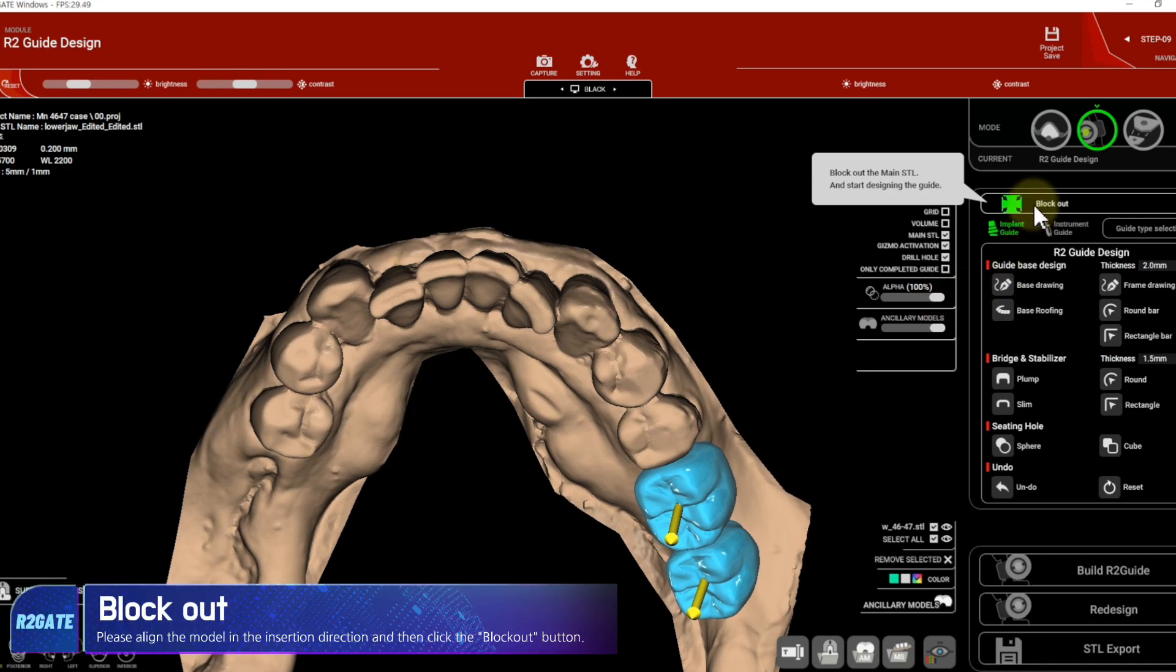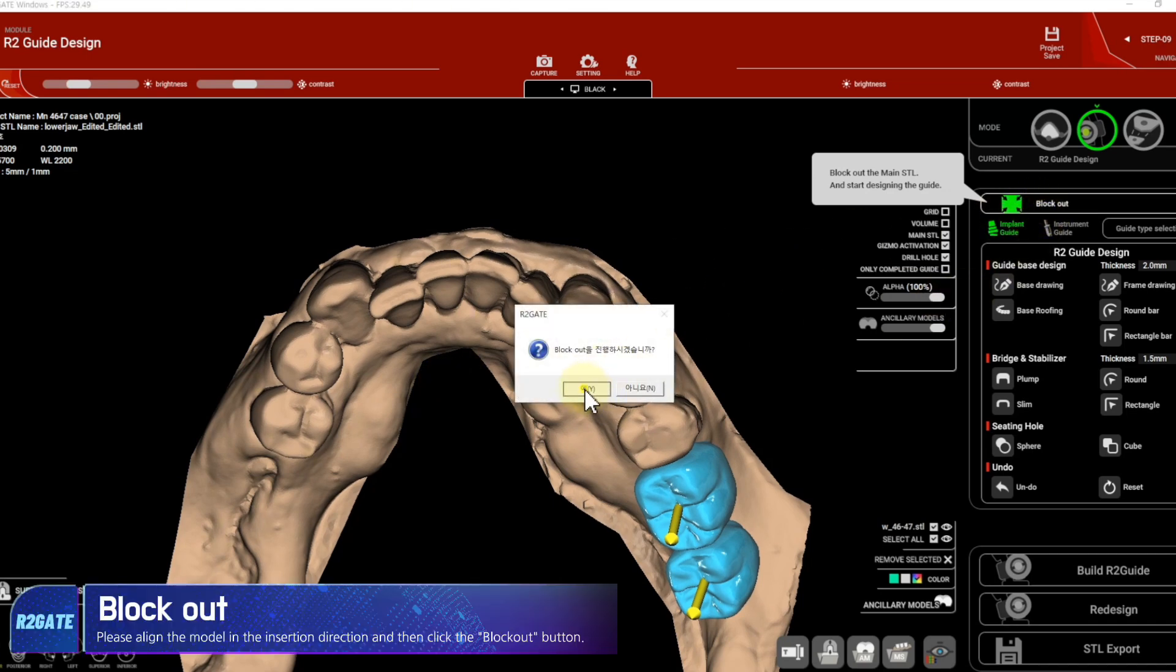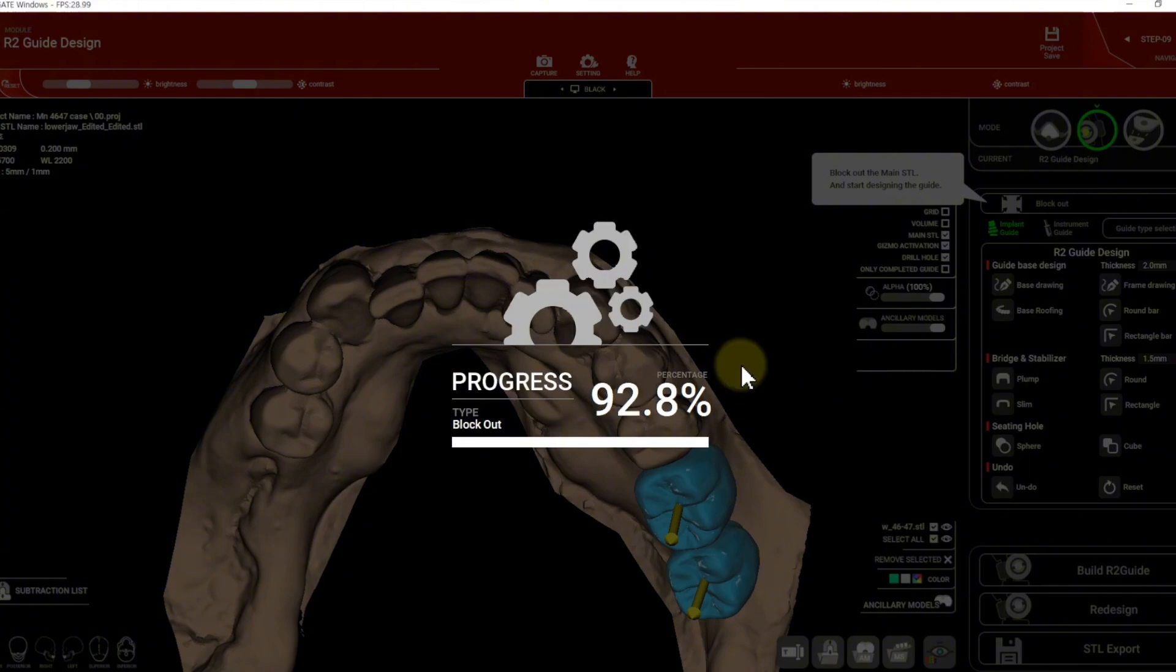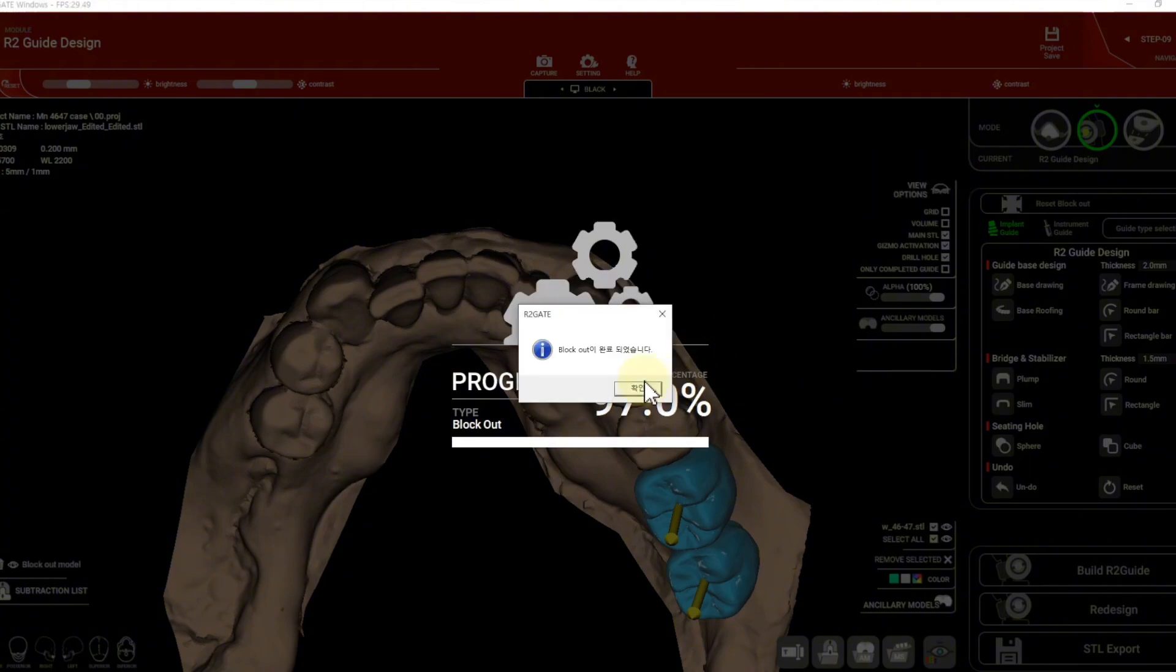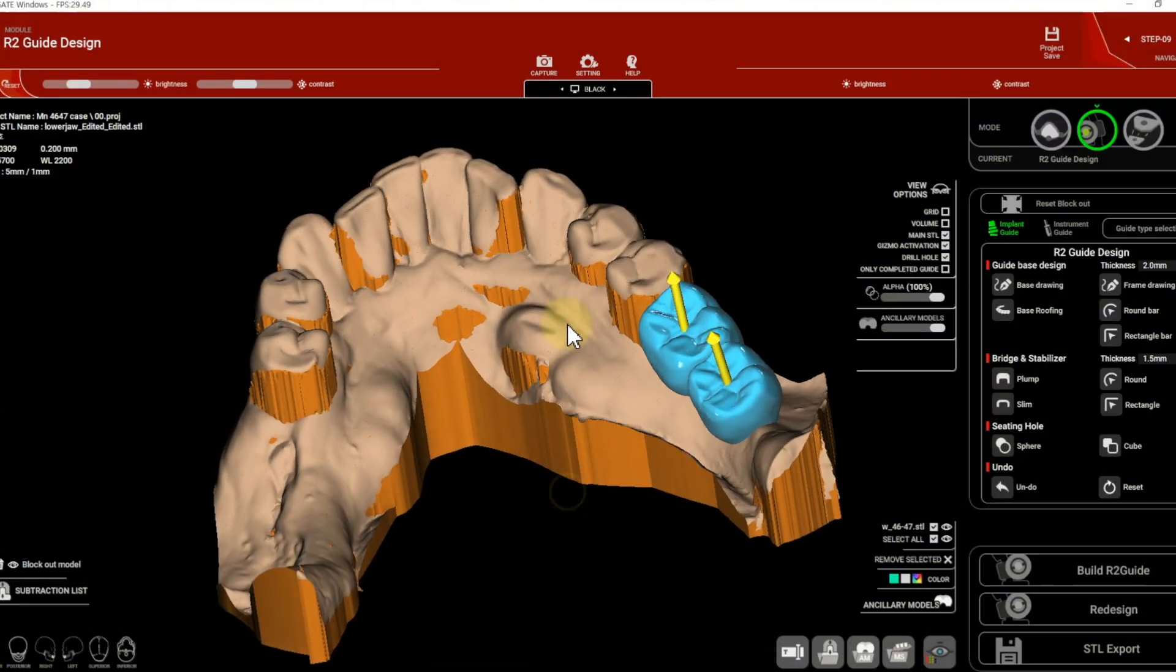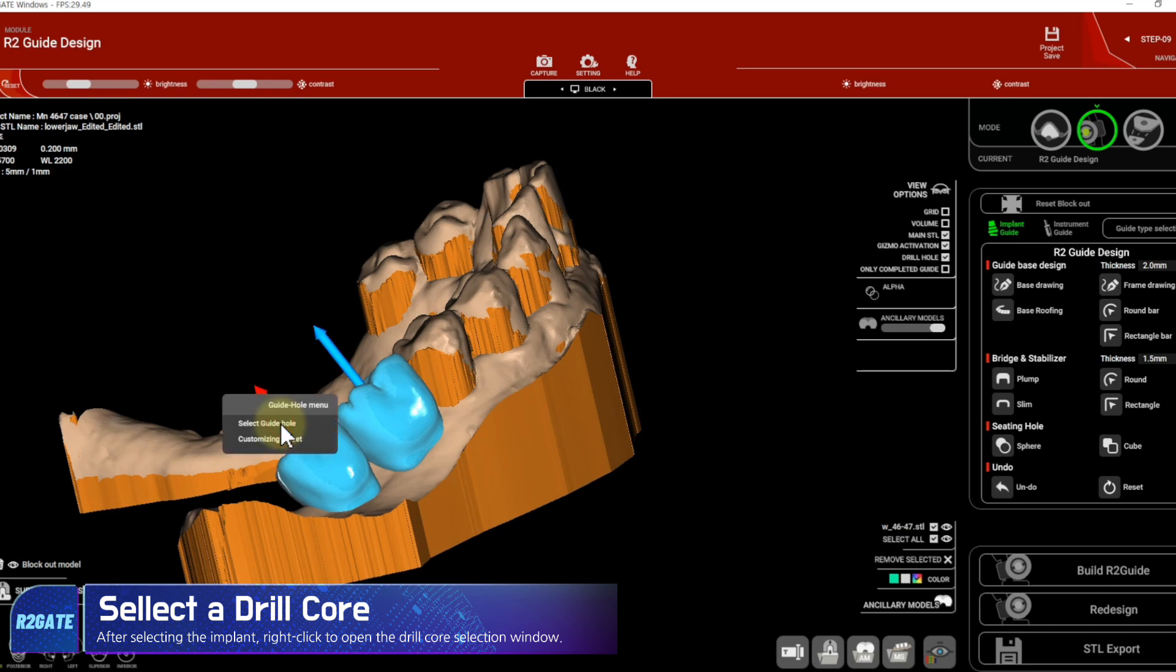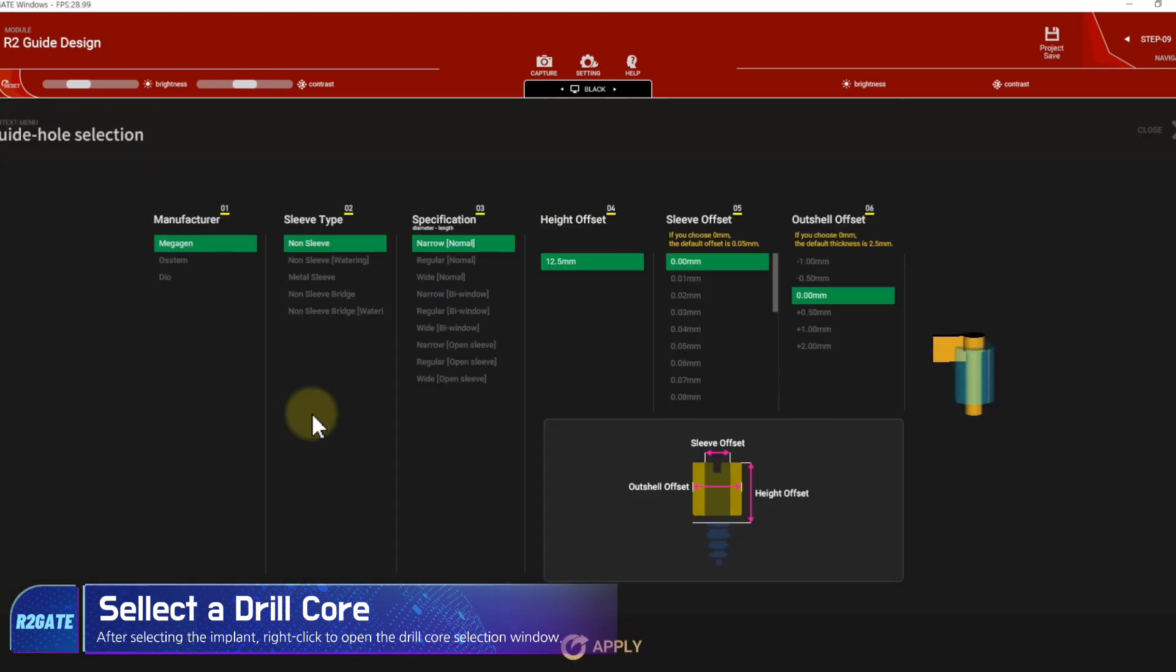Please align the model in the insertion direction and then click the block out button. After selecting the implant, right-click to open the drill core selection window.